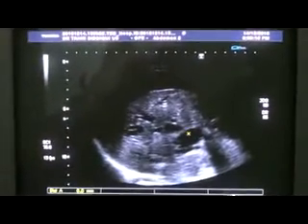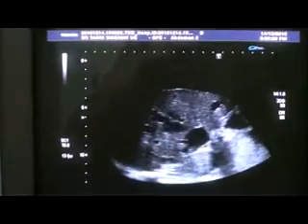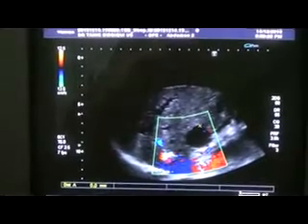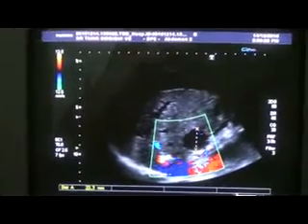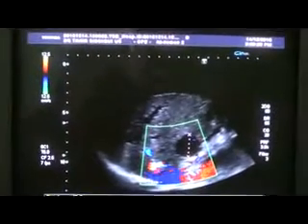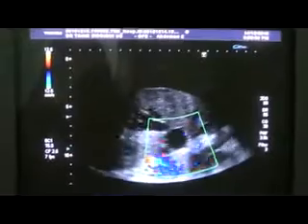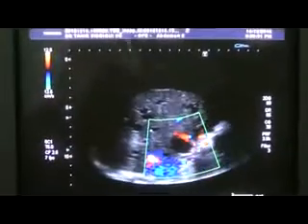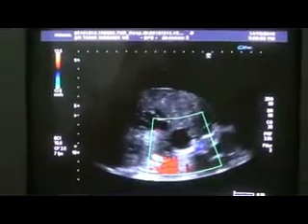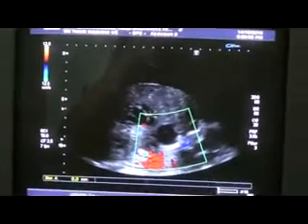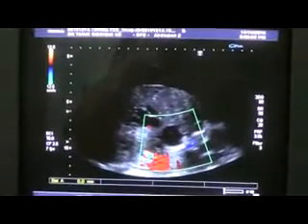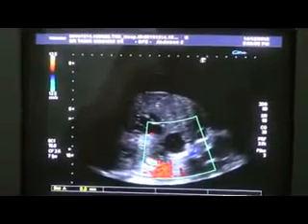This is the dilated common bile duct in transverse section. It does not take any color. It's up to 22 millimeters — significantly dilated CBD. This is the hepatic artery, and this is the portal vein.